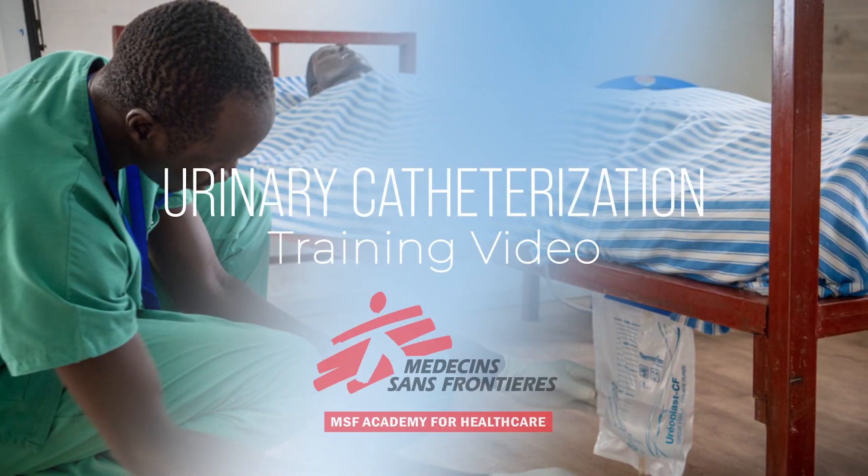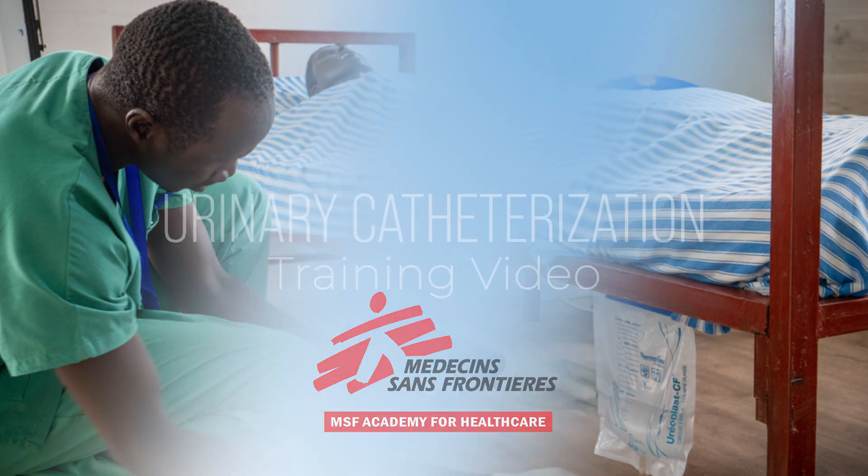Hello, and welcome to this instructional video. Today, we will demonstrate the procedure of inserting, maintaining, and removal of a urinary catheter.